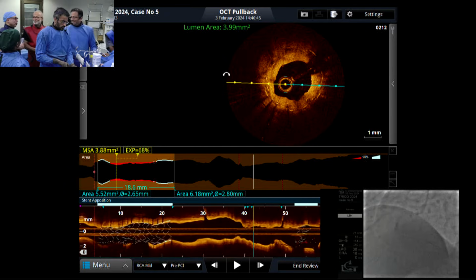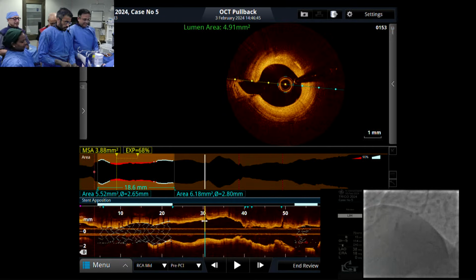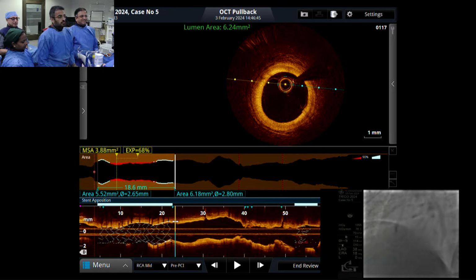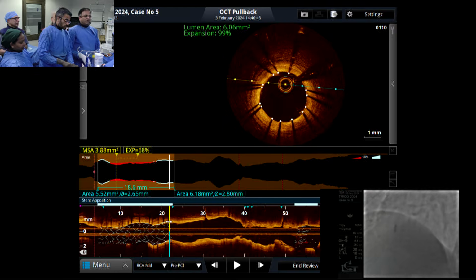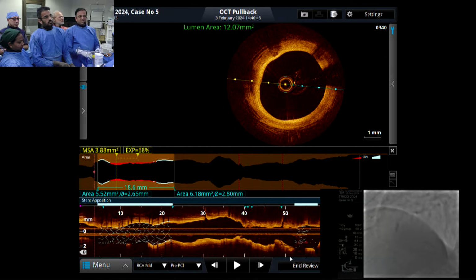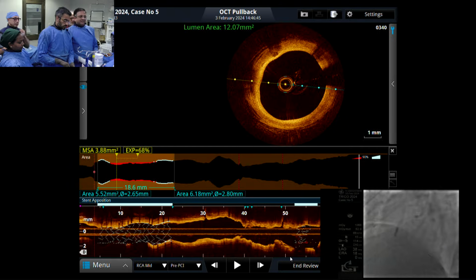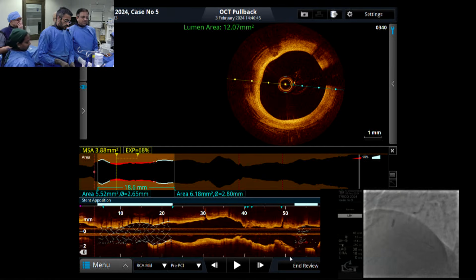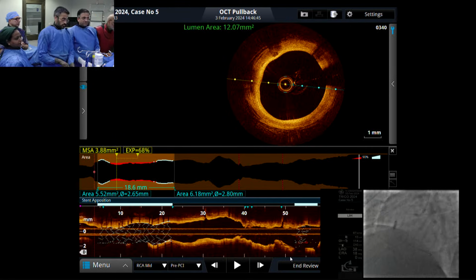Dr. Pancholy, just show the audience how to deal with the cutting balloon, gradual inflation, deflation. Why are we doing such steps? Just briefly describe. Yes, sir. We go up 1 atmosphere every 5 seconds with the Wolverines especially. The mechanism is the blades actually come out first, and then as you increase they dig into the plaque. What's the maximum inflation pressure? I think the rated burst on this is in the 14 range. Although I have gone to 20 easily on this, here I think we have a very good size.